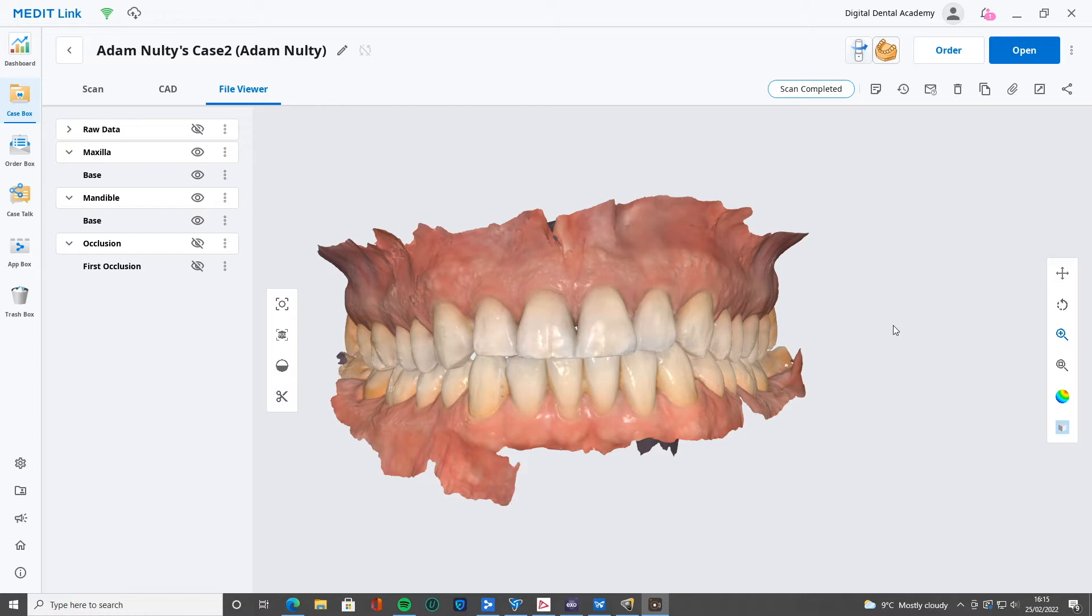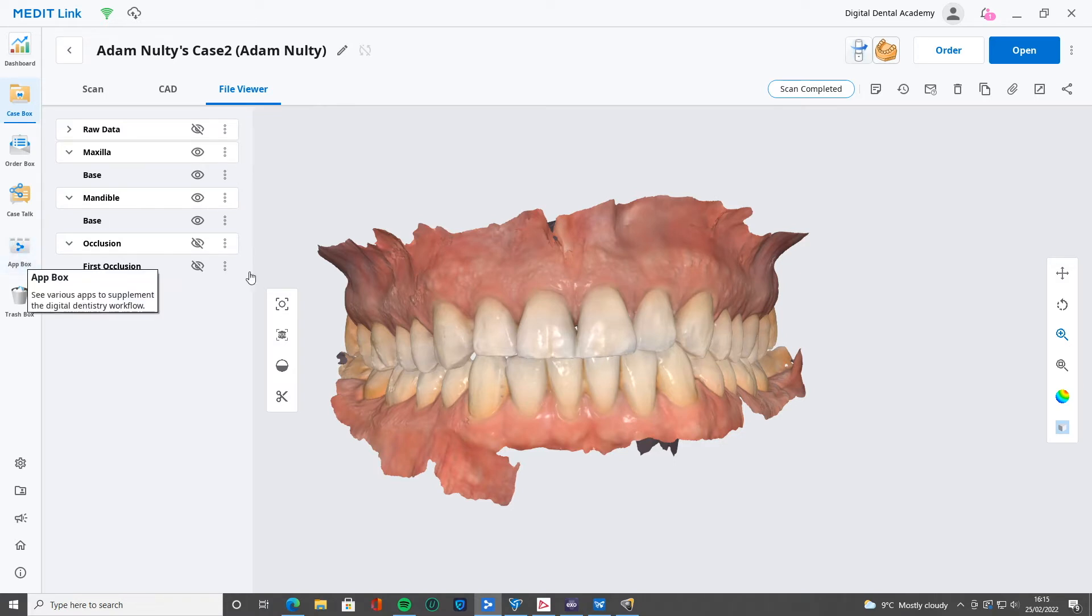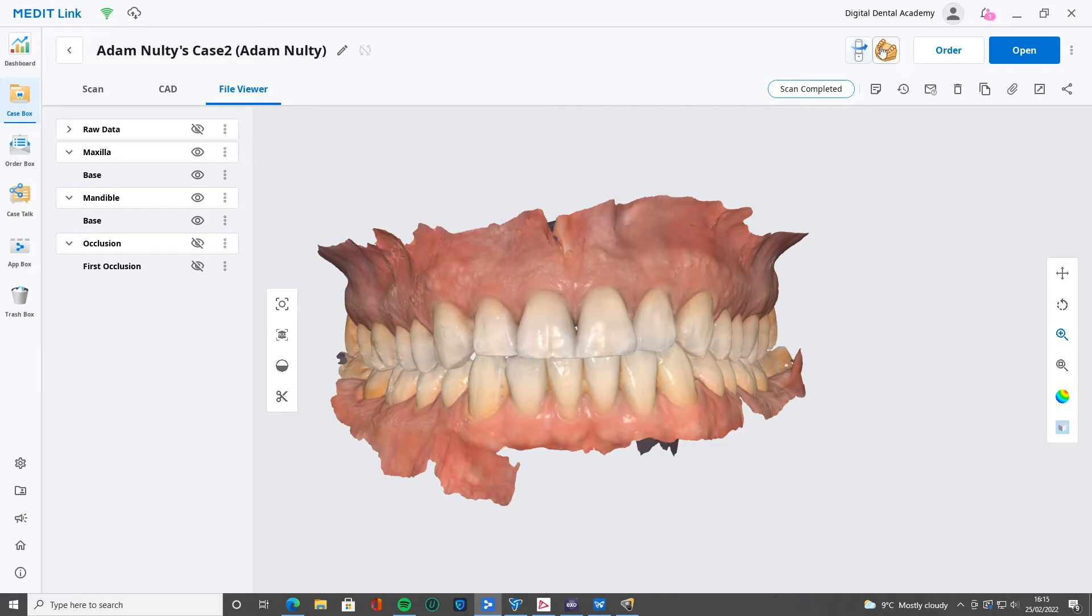Once you have gone into the app box here and installed MeditLink Model Builder, then you'll see this little icon up on the top right here, that's a little yellow or beige model. That's next to the calibration tool wizard. So let's just take this scan, click that Model Builder, and it's going to boot it up.